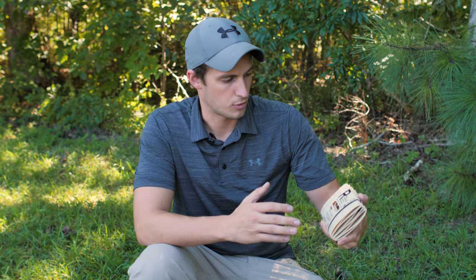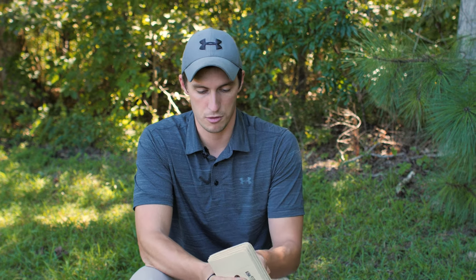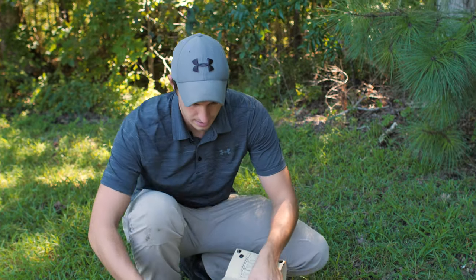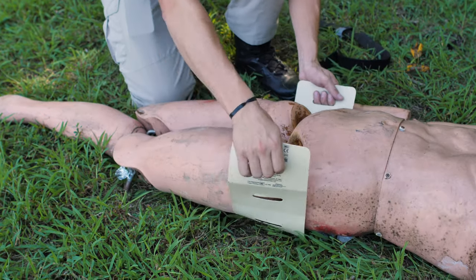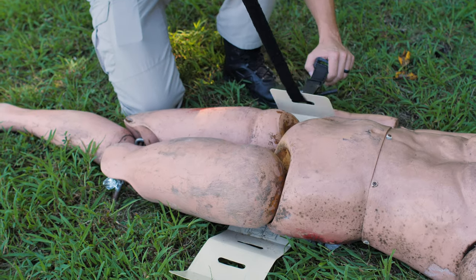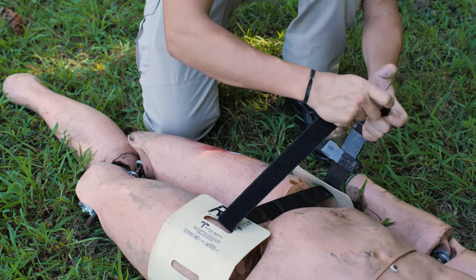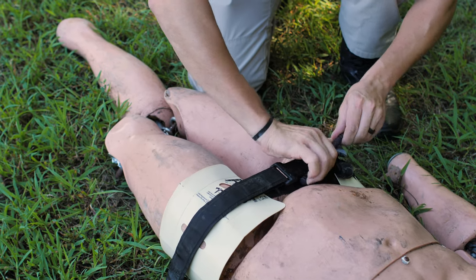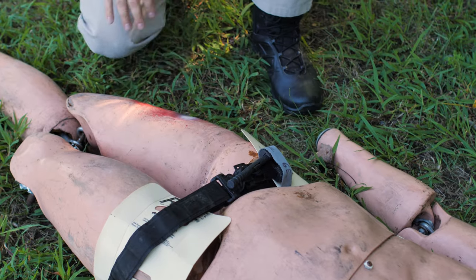I have a RISE splint here — RISE stands for Rigid Immobilization System for Extremities, put out by Tactical Medical Solutions. This is a multi-purpose splint you can use not only for fractures but also as a pelvic binder. We make a sling out of it and use a tourniquet to stabilize it in place. Slide it under a void under the knees, then take the tourniquet and loop it through a loop on one side all the way down to the buckle, pull it back on itself, keeping proper position. Tension it down with just a couple of turns — this doesn't need to be nearly as tight as a typical tourniquet — just enough to keep firm pressure to stabilize the pelvis.